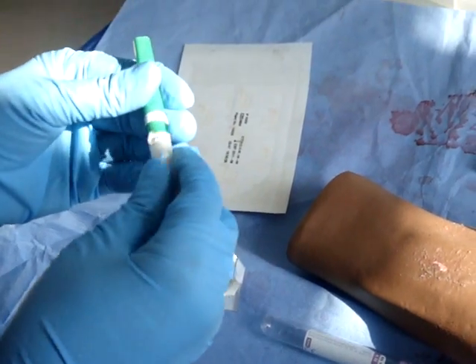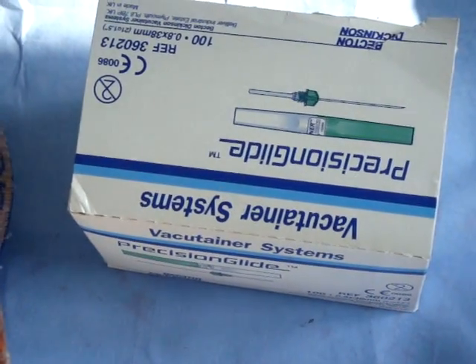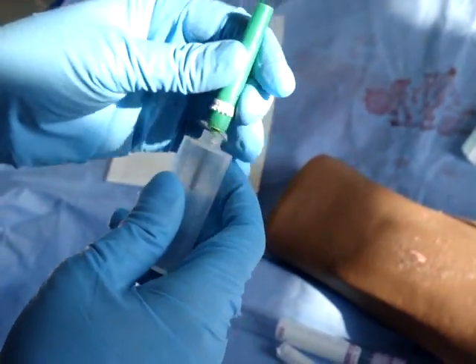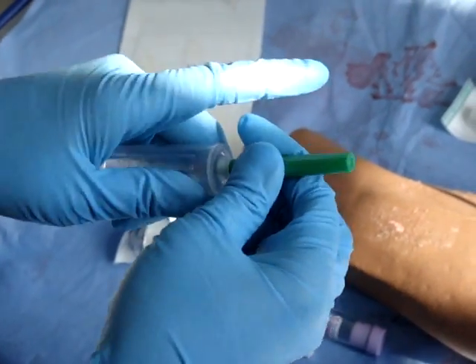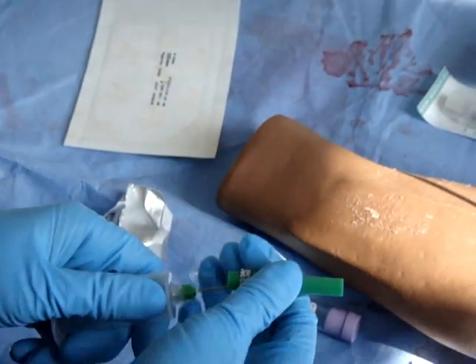Remove the white parts off the Vacutainer precision glide and place into an open back syringe and screw this in. Pull off the green cap.